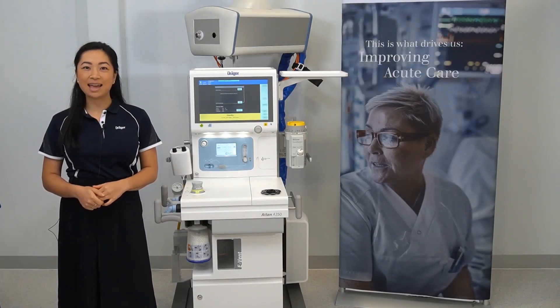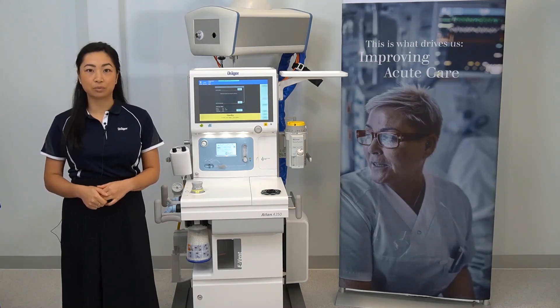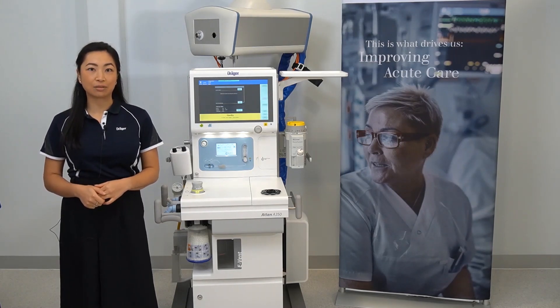Hi, my name is Samantha and in this video I'll be demonstrating the disassembly and reassembly of the breathing block for the ATLAN A350.